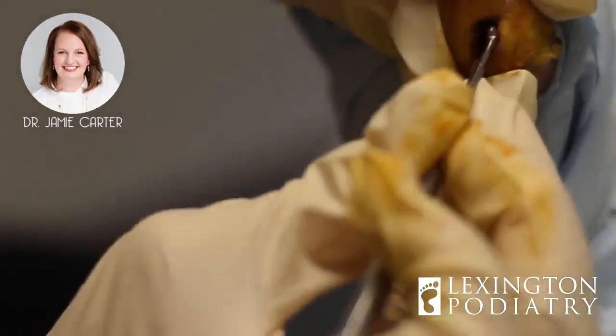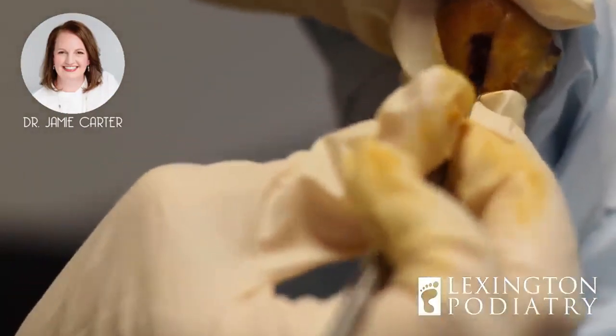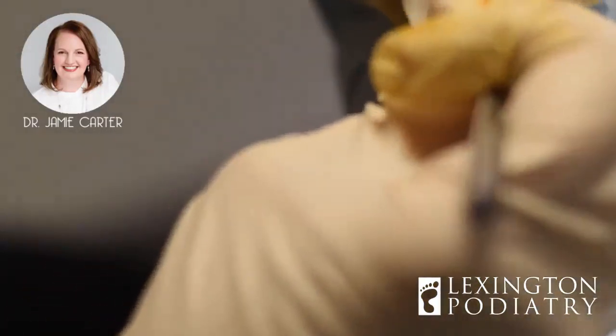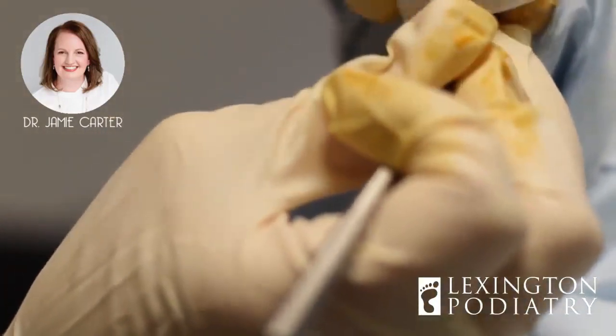So I'm trying just to loosen it up a bit. And then we're going to nip it as far down as I can get it because I don't want to leave any of the bone in there that is infected. Okay.